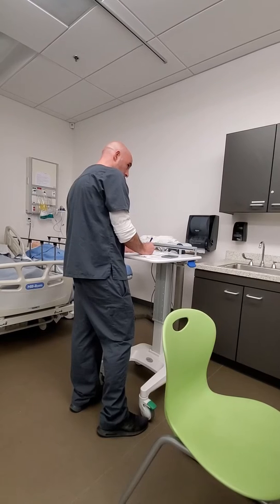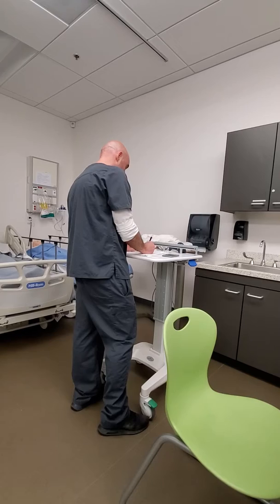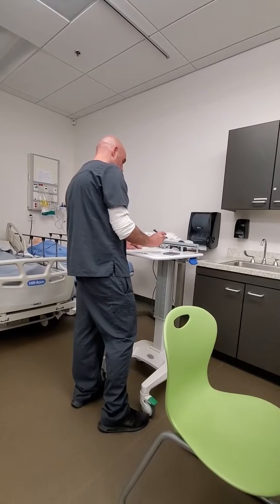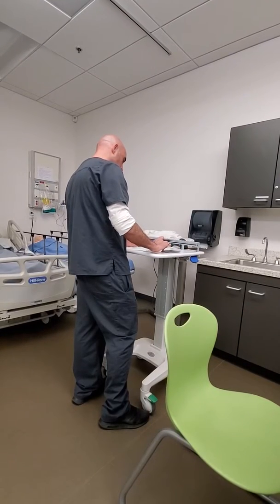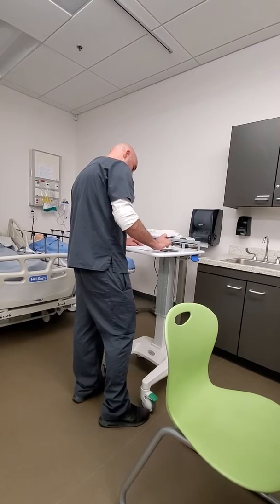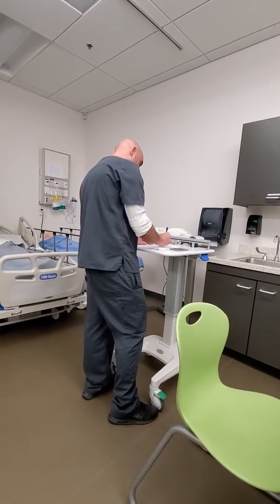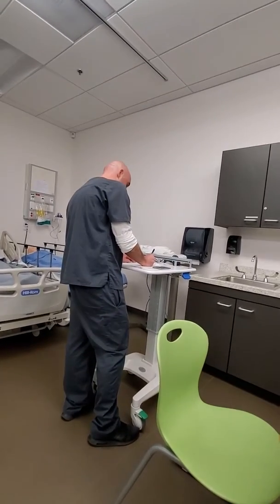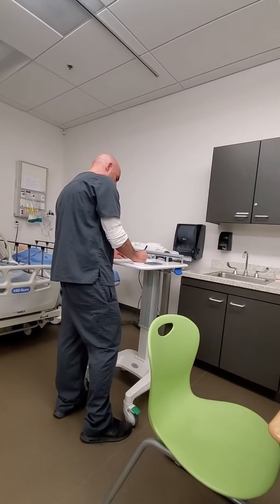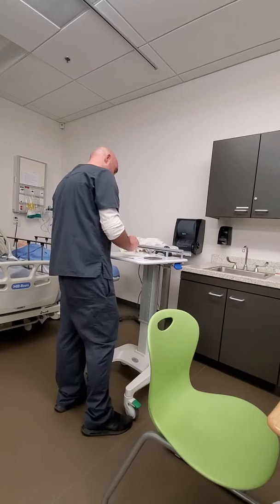You want us to show work? We calculated it. Okay. What was it? Just curious. 1 gram of Ansef in 100 mLs to go in over 45 minutes. Over 45 minutes, so this is going to be 133 milliliters per hour. Good. That is what I'm going to program the Alaris to.